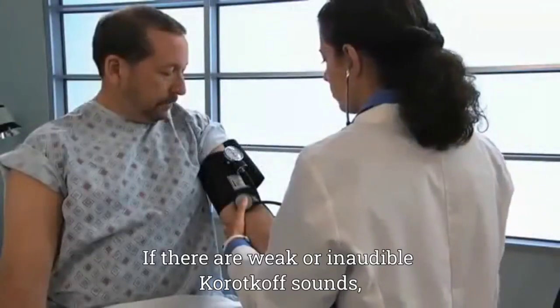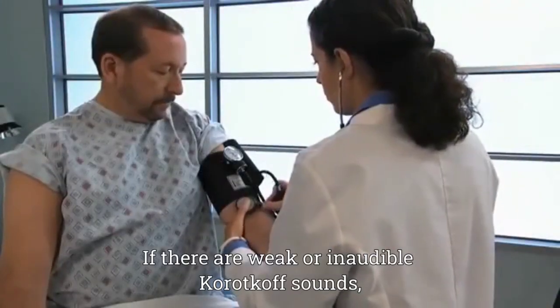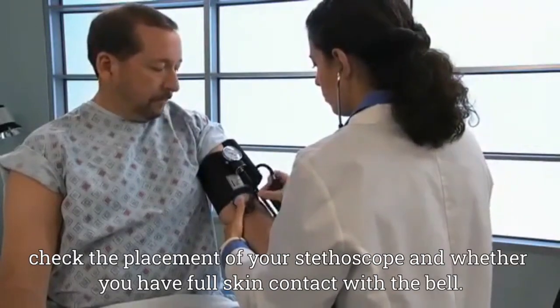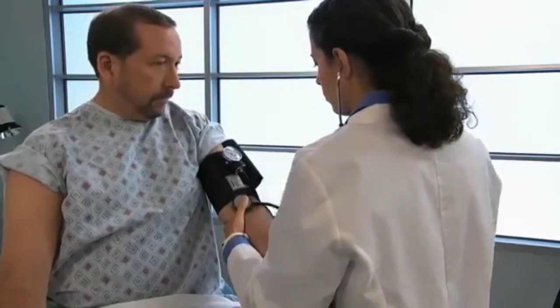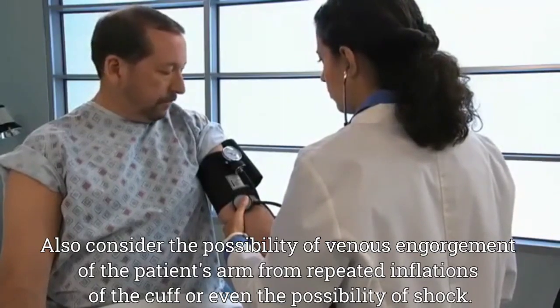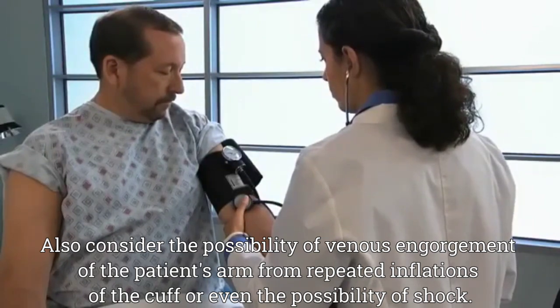If there are weak or inaudible Korotkoff sounds, check the placement of your stethoscope and whether you have full skin contact with the bell. Also consider the possibility of venous engorgement of the patient's arm from repeated inflations of the cuff, or even the possibility of shock.